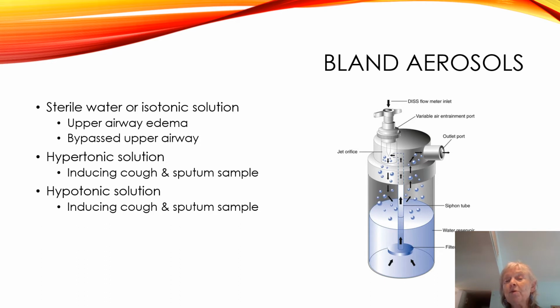And if that's what we're doing, we need to be there with them, because if these people are starting to cough, sometimes they'll also start to wheeze, and they'll have an increased airway resistance and increased work of breathing. If that is happening, then what we need to do for that patient at that point is to say, we're going to stop this treatment, and if we have an order for albuterol or another bronchodilator, we'll go ahead and administer it at that point, because we need to get the airways more relaxed.